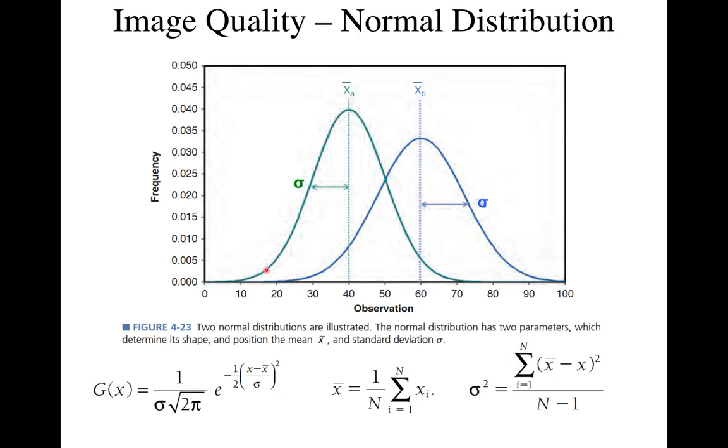So to quantify that, you can ask what's my average signal value? This average value would be like photons detected. And if I did a number of trials and looked at the histogram of my measurement for those trials, it would fall on this normal distribution. A Poisson distribution turns into a normal distribution as n gets larger. They're pretty well indistinguishable as n gets larger. So the way we characterize it, and we've already looked at this to a certain extent, is I have a mean value for a measurement, and then I have this distribution of possible measurements that I would take.